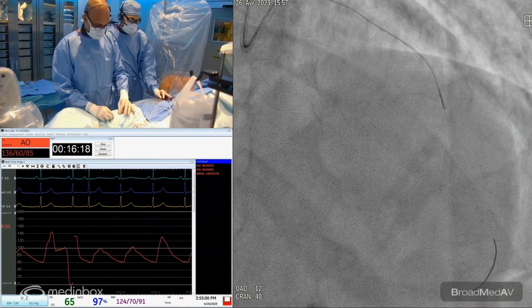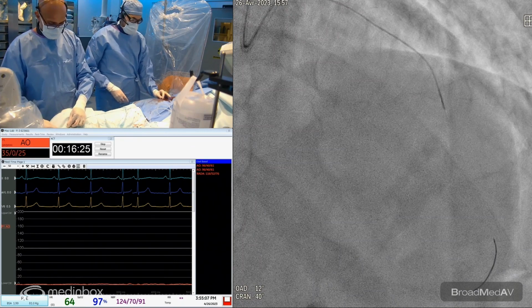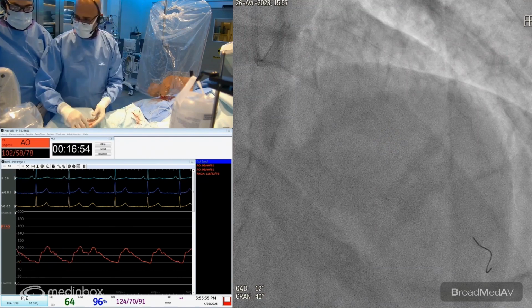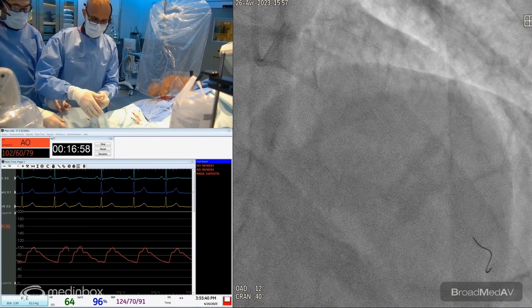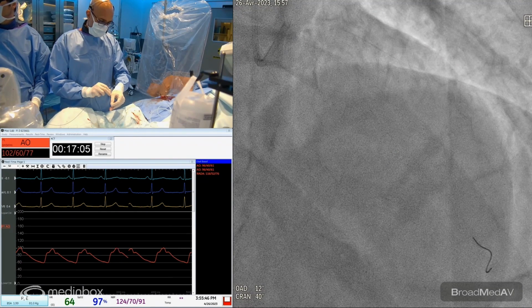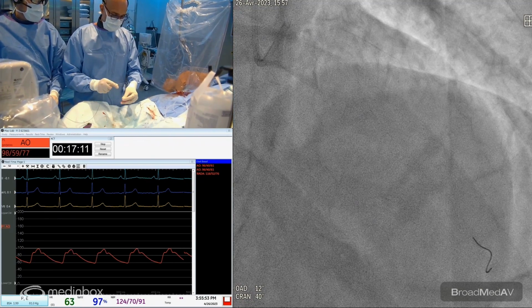So the orbital atherectomy has 2 speeds versus the rotational. It has a 80,000 or 120,000 revolutions. Fluoro. It's recommended to loop your wire so you have full control. I prefer to use the one-man technique when doing my atherectomies. That way I have full control. Let's start the flush, on flush. As you can see, the diamond burr, where you can perform antegrade and retrograde sanding. And if you look carefully, it's eccentrically mounted.